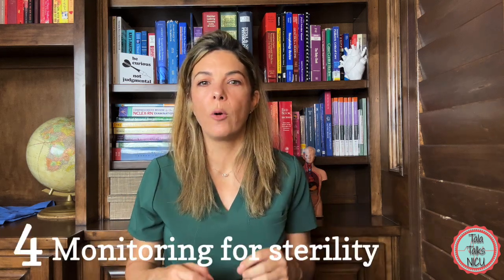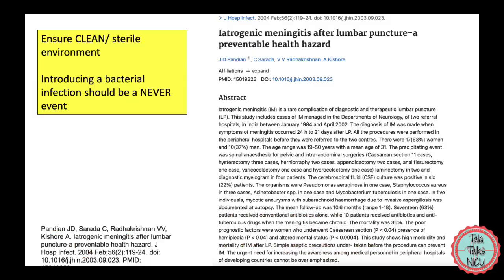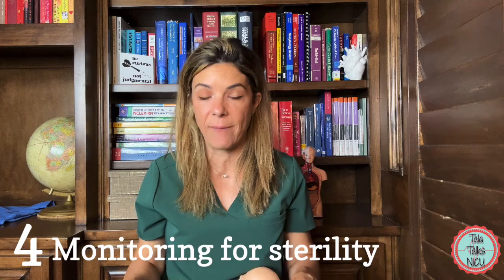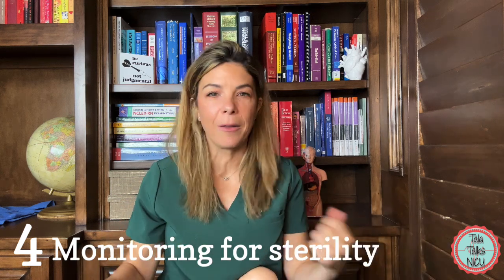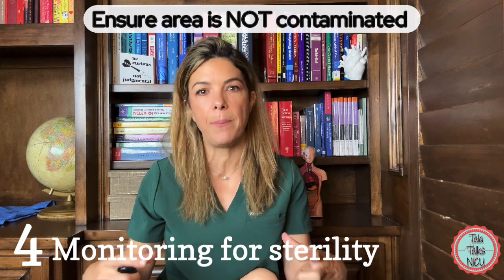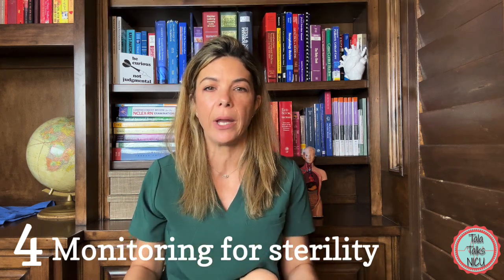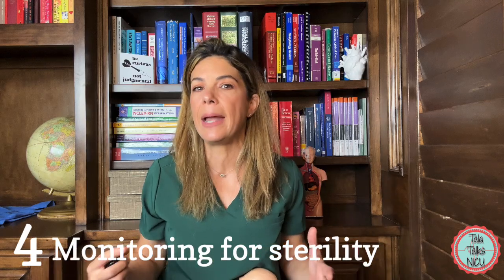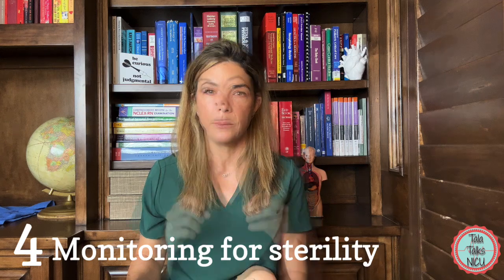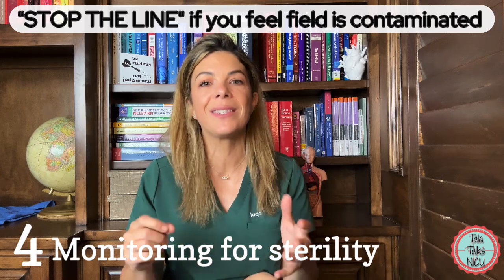Four: monitoring for sterility. One of the risks of doing a spinal tap is introducing a pathogen into the cerebrospinal fluid. This should be a never event, and we prevent it by making sure the area is clean and disinfected. If the baby is kicking and thrashing, it can be hard to maintain the sterile field — be aware of that. Every hospital has different protocols: whether it's a cap, gown, mask, or some combination, anyone near the field should be wearing sterile gloves. If you feel the sterility of the field has been broken, say something.